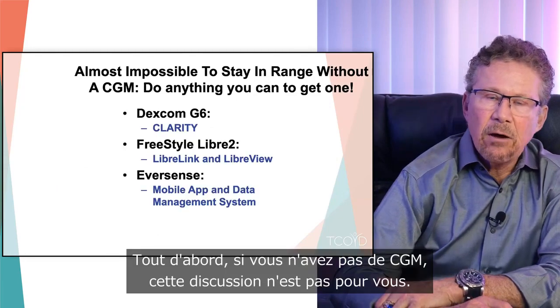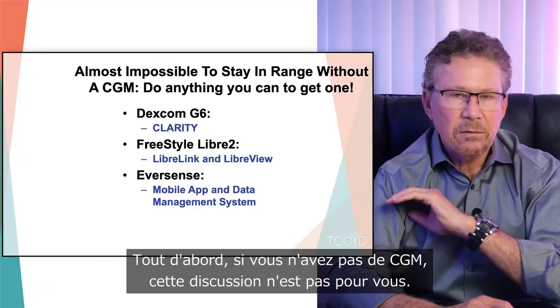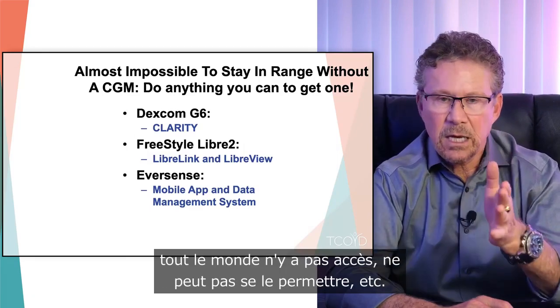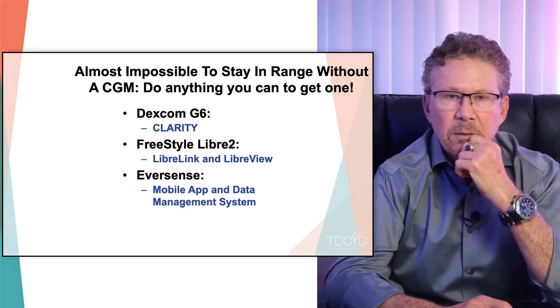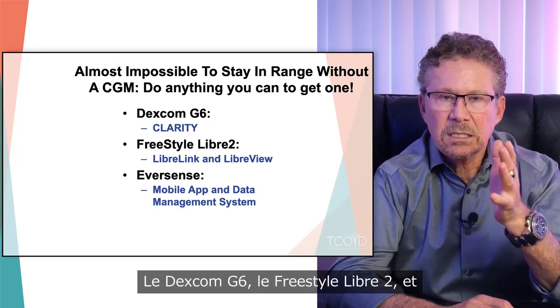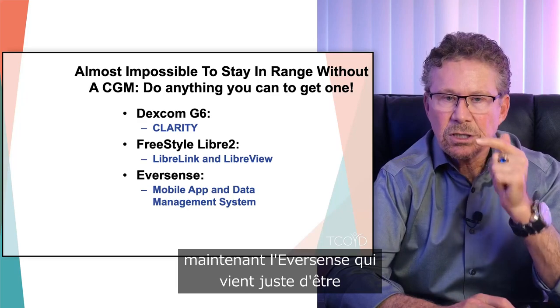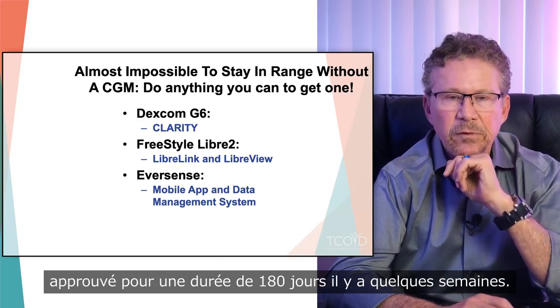Okay, now, first of all, if you don't have a CGM, this talk's not for you. And I don't want to put you down because not everyone has access, can afford it, etc., or it may have a nerdy doctor. But these are the main CGM devices: the Dexcom G6, the Freestyle Libre 2, and now the Eversense that just got approved to be 180 days, and that was just approved a few weeks ago.